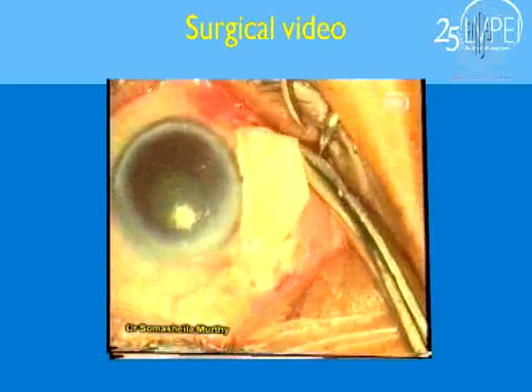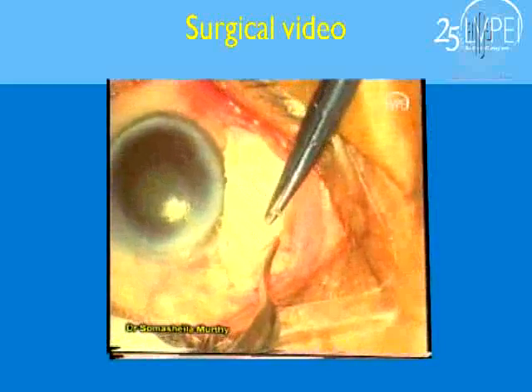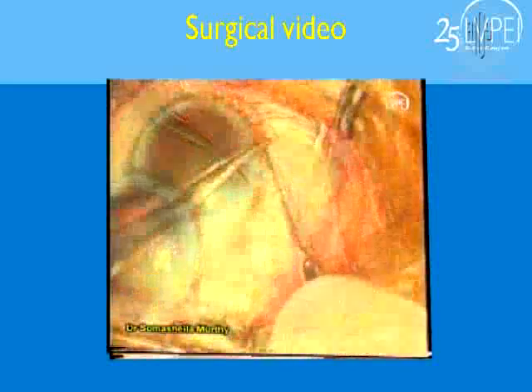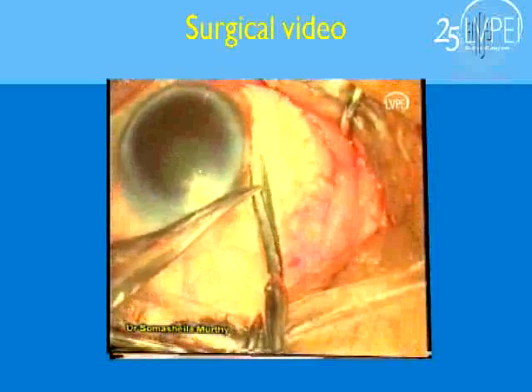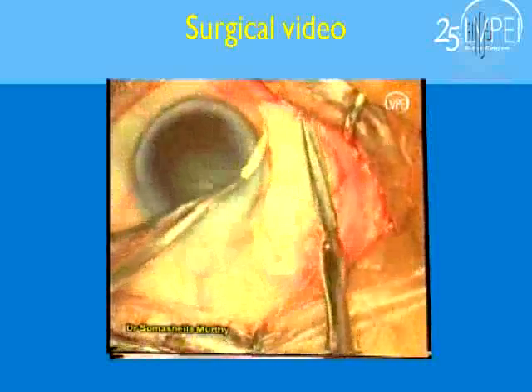This area was covered because the conjunctiva was unhealthy, as I mentioned. So an autograft was taken from the same eye to cover the area of bare sclera. You cannot leave this area exposed. You should either use conjunctiva from the same eye or the fellow eye.